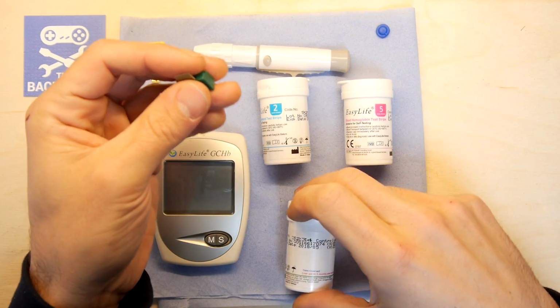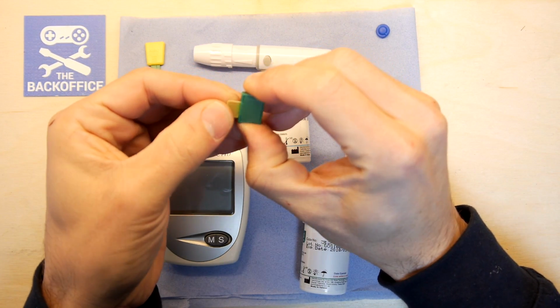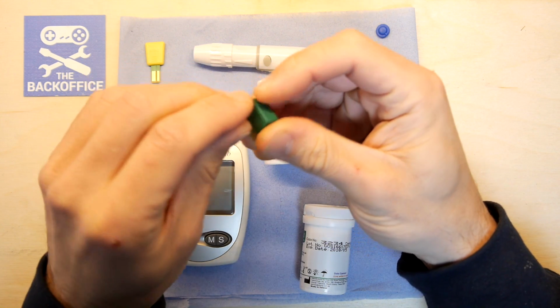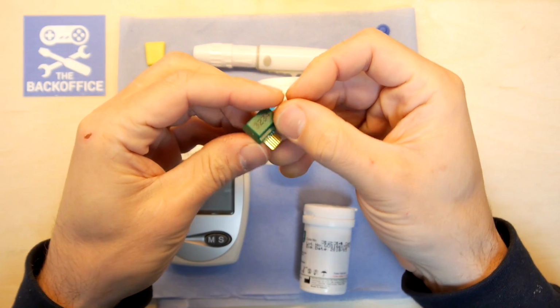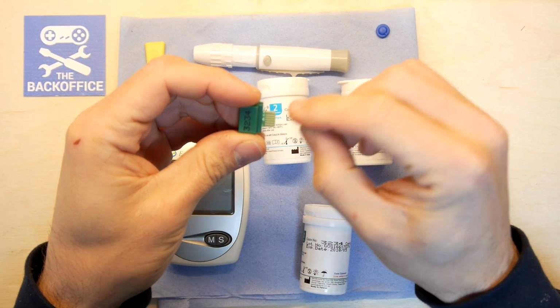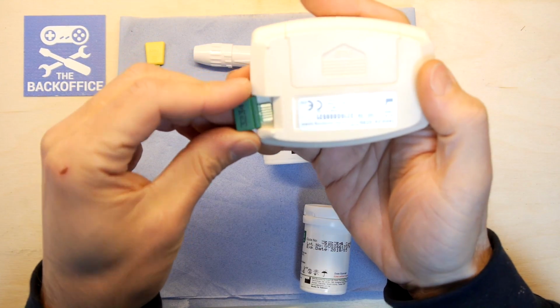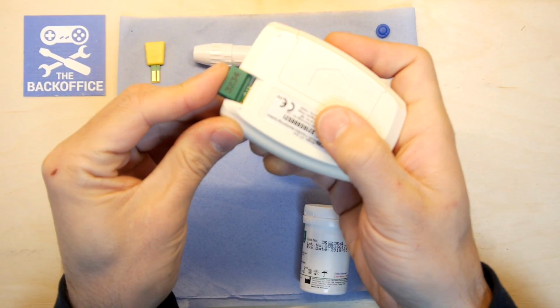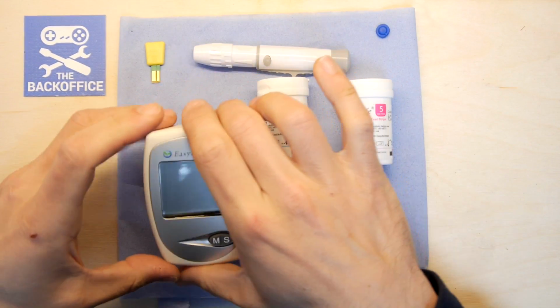When these eventually expire, I guess we're going to pop this open, see what's actually inside there. I suspect it'll be a resistor wired up in different values, or it could be a digital thing. Who knows? So apparently we pop that in the machine. I think that's the only way it can go. 3234. So the machine is now calibrated to that.